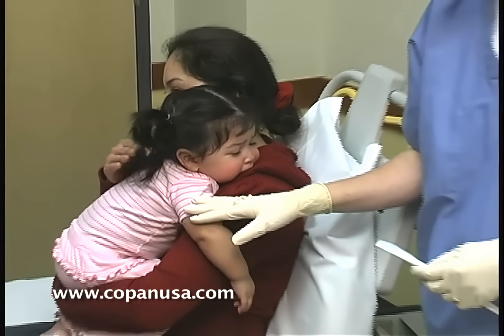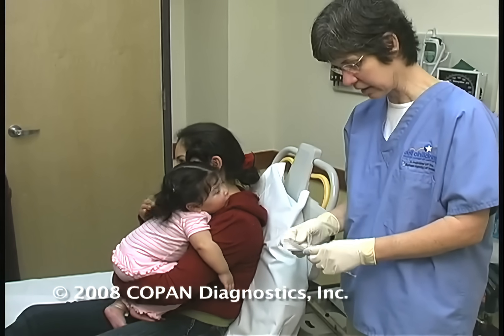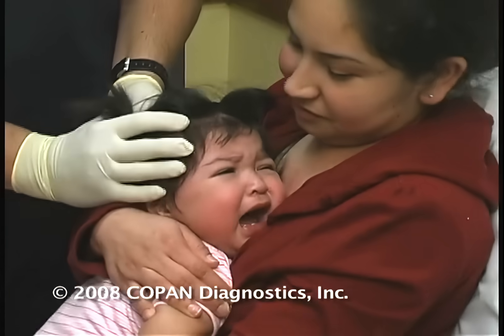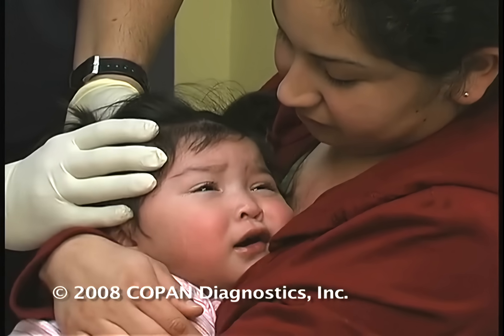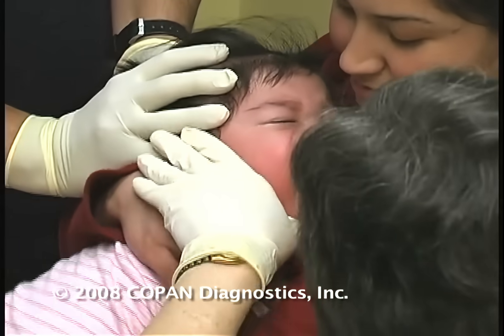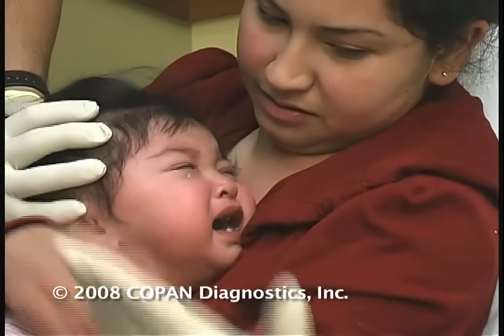This is little Mayte. She is 10 months old and she's here today with a fever of 104 and having some flu-like symptoms. We're going to get a quick NP swab on her so that we can test her for flu during her visit today. Sometimes with the younger babies, we have to have a little extra holding help — the mom in this case will hold, and I've got a second person here who's helping to hold the head steady. We're going to do the same thing: go in horizontal, rotate under the turbinate, and we're done.